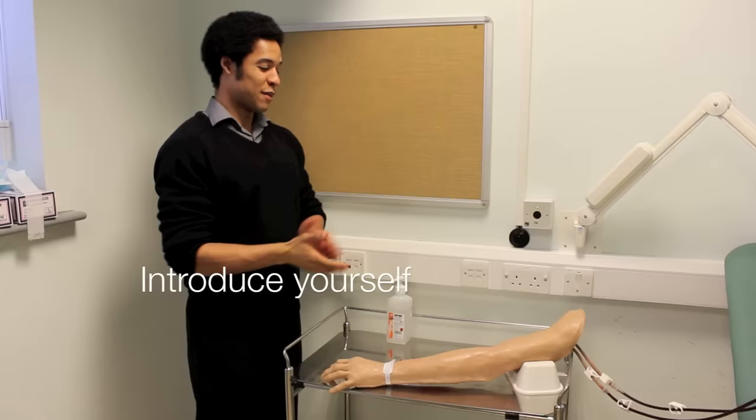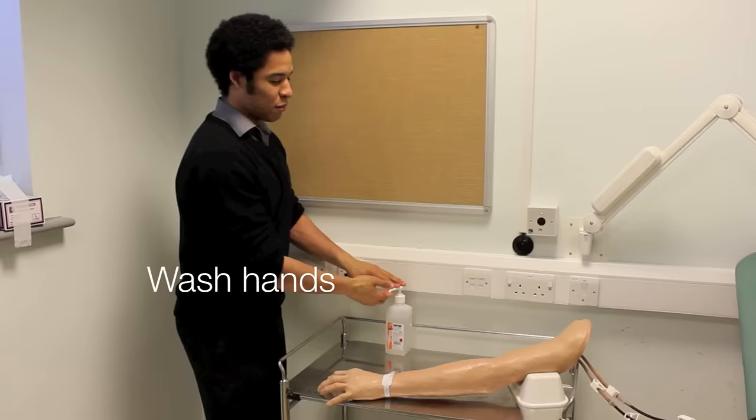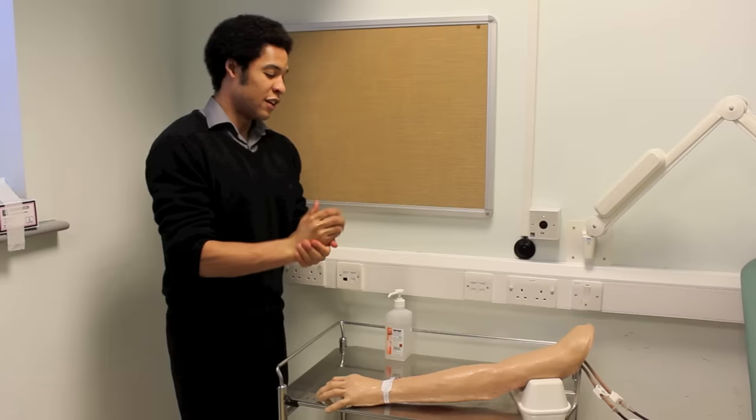Hi, my name's Adam, I'm a 40 year medical student. Could I check your name please? And what's your date of birth? What I've been asked to do today is to come and take some blood from you. That will involve putting a small needle into one of your veins and it will feel like a sharp scratch. Would that be okay?